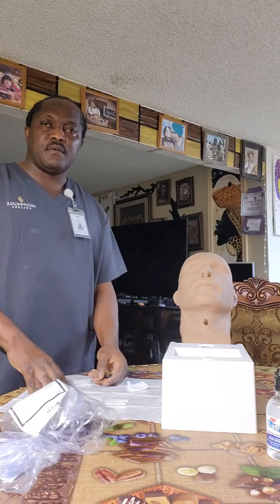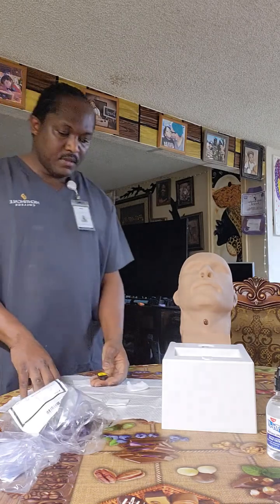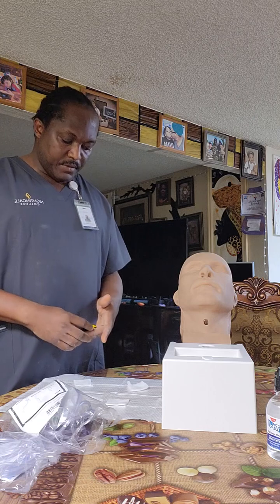My name is Kofi. In this video, I'll be performing oxygen administration. So, I'm basically in the patient's room.